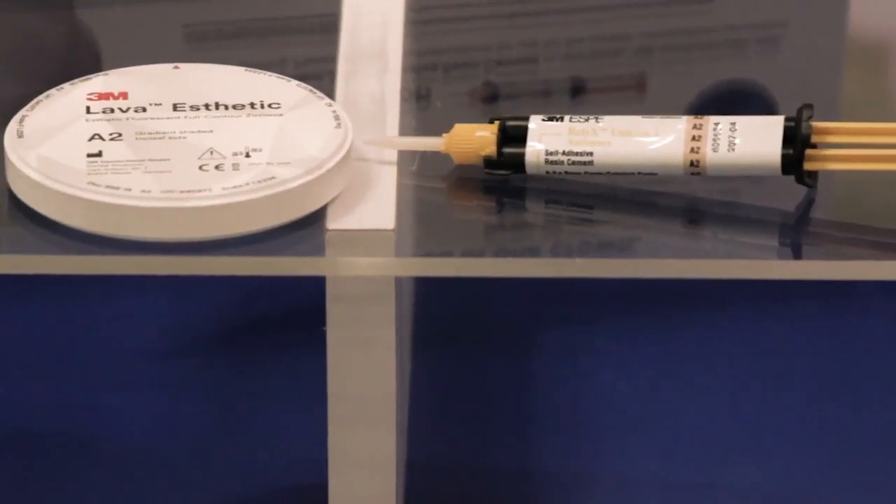The 3M Lava Aesthetic, in our opinion, is the most aesthetic, most lifelike and vital of the zirconias. Having a monolithic material that's strong and also has the characteristics of natural teeth — with the light transmission and the nice shade matching — we just get great results. It's simple and predictable.